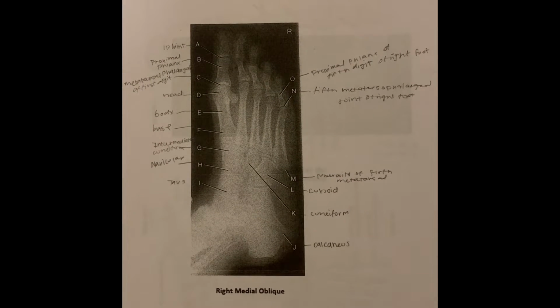Hey guys, today I'm going to be doing the right medial oblique foot on my boyfriend.